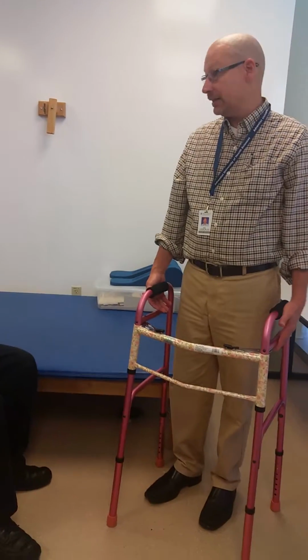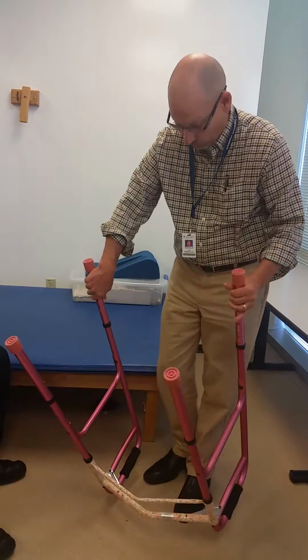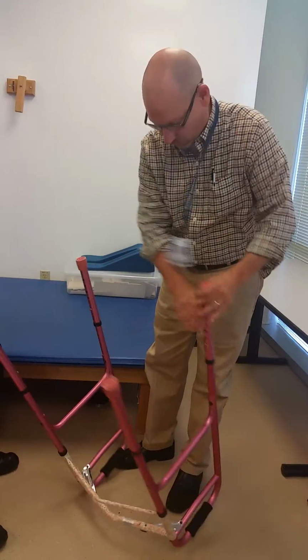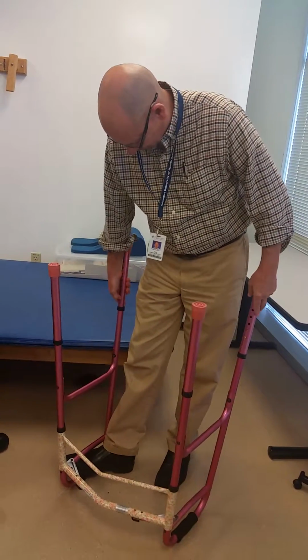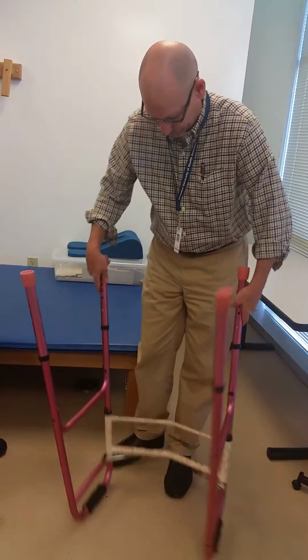This probably needs to be a little bit taller, right? So I'm going to eyeball it. Easiest way is just turn the silly thing over. I see students all the time trying to do this. Don't do that. Just turn the thing over. Put your foot on it if you want to hold it still. And I'm going to take it up as high as it'll go. You like pink? Good deal.